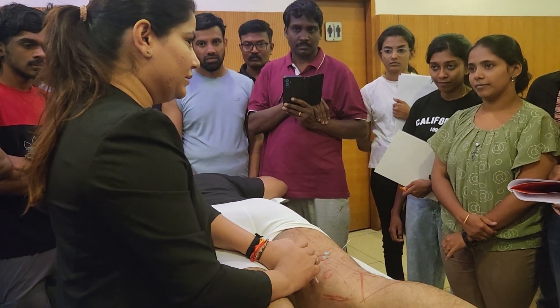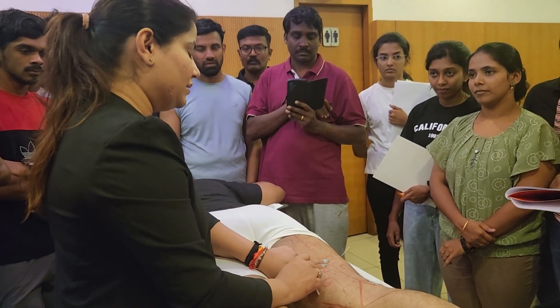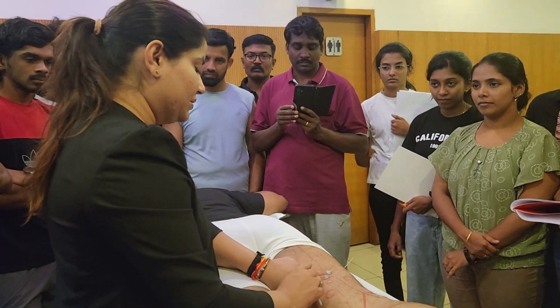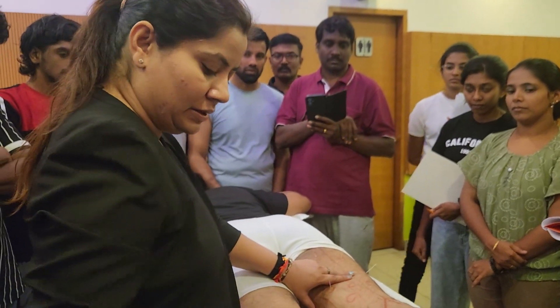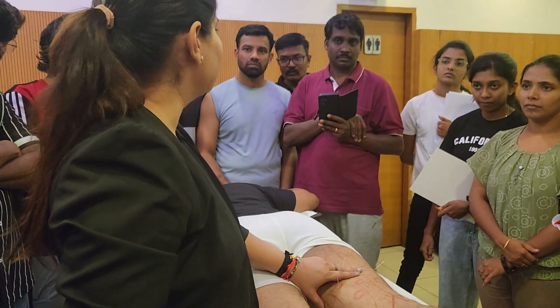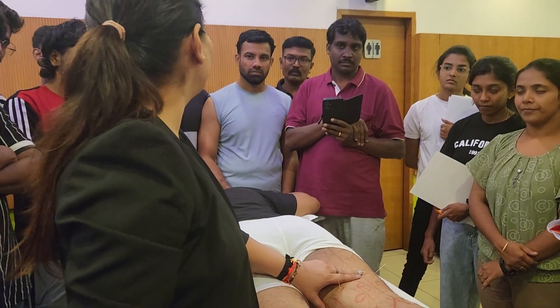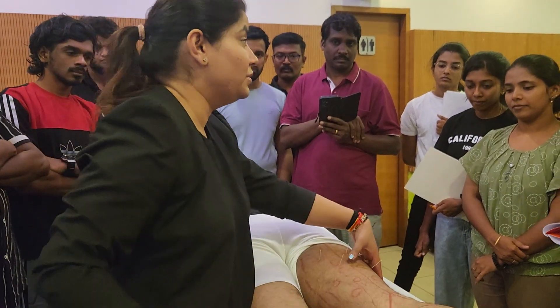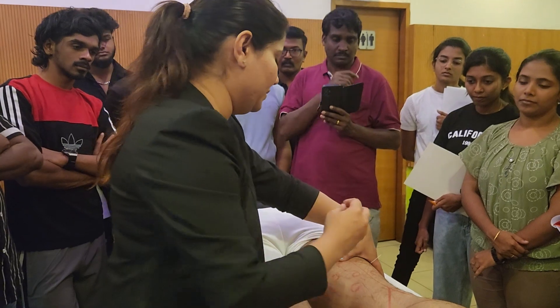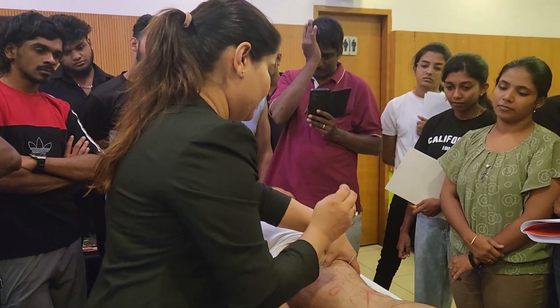When the muscle is contracted, first thing the result will be lesser. Second thing, you will not get twitches, because already the muscle is contracted, so a twitch won't be there — the muscle will not release properly.